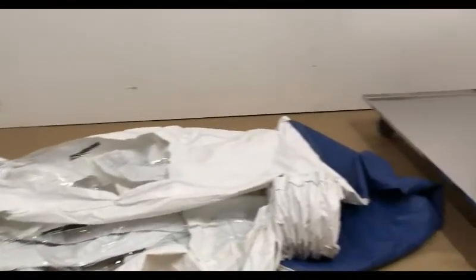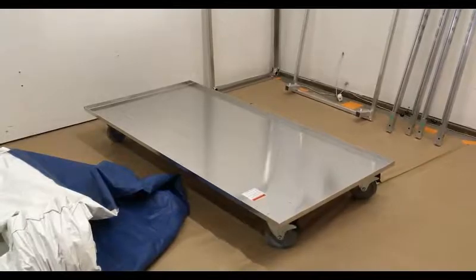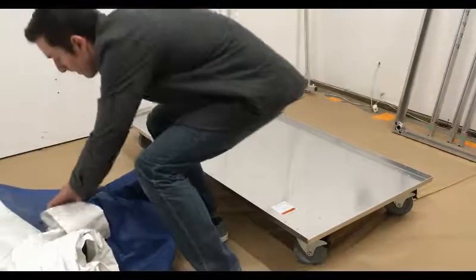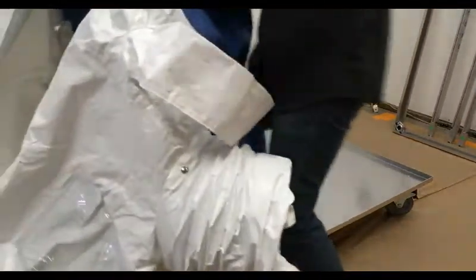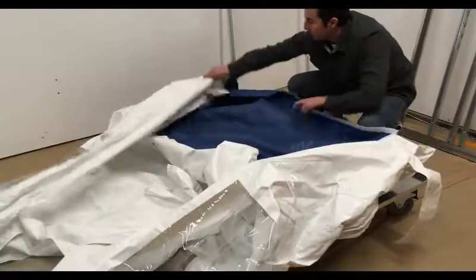To begin installing the HEPA cart, lay the blue base of the tent next to the cart. With the wheels of the cart locked, pull the blue base of the tent onto the top of the cart. Line the corners of the base up with the corners of the cart.